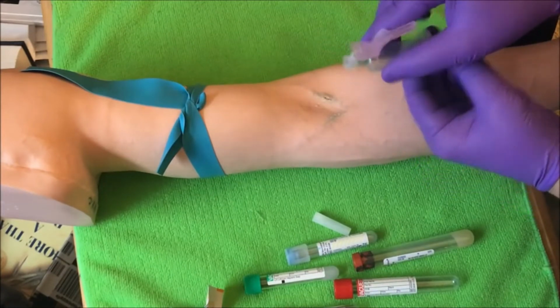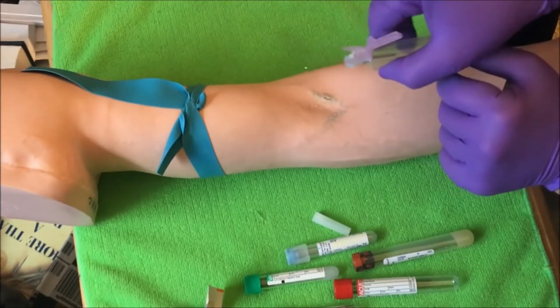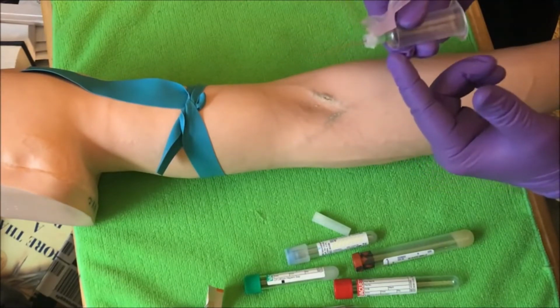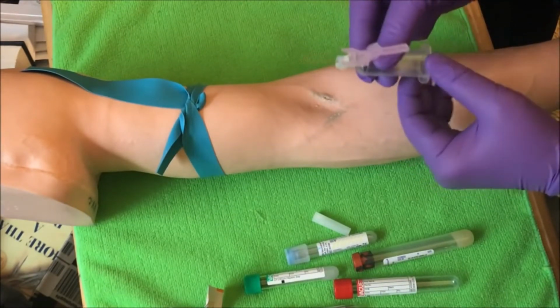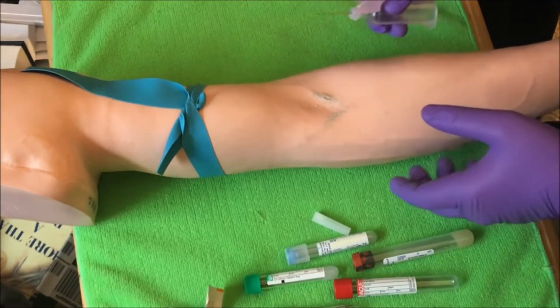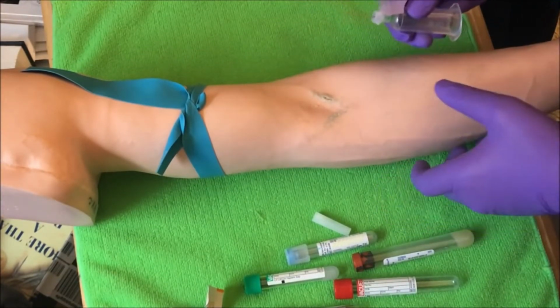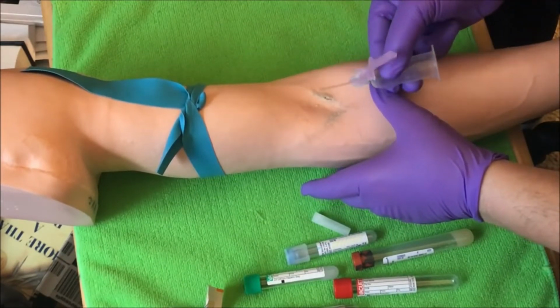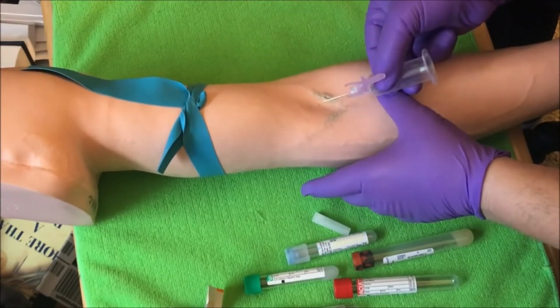Some people hold it differently. Some people hold it like this. It's a little harder for me to get tubes in here, depending on your preference, but I prefer 2 fingers and a thumb closer to the front of the vacuum holder. And once I'm ready, I'm going to anchor the site or retract the skin. I don't want to retract up here close to the site where my needle and my hub have to go over my thumb.